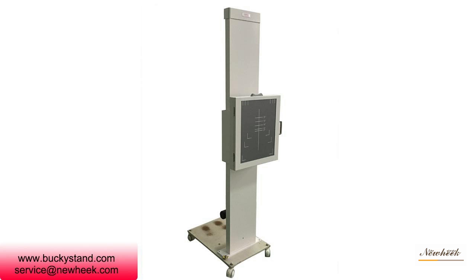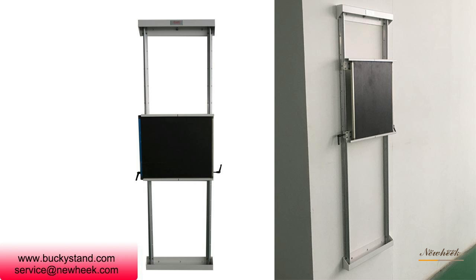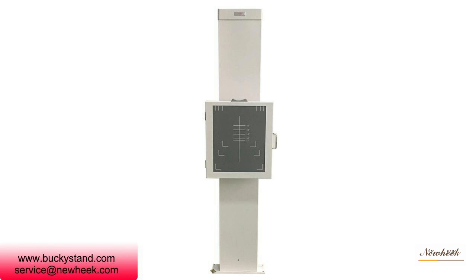And our filter grid, according to the structure, is divided into parallel grid, convergent grid, and cross grid. Our grid can be different according to your needs. The height of our bucky stand is about 2 meters, and the size of the film box is divided into 14x17 inches and 17x17 inches.